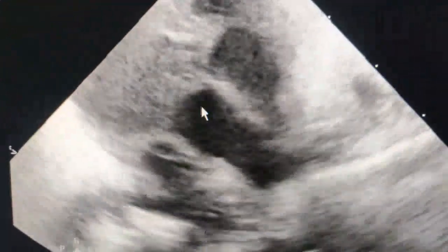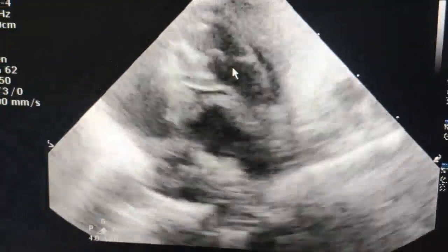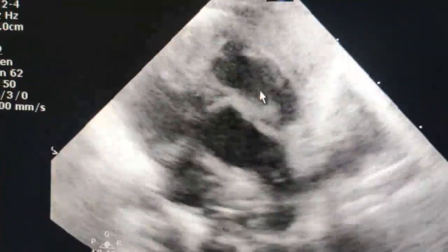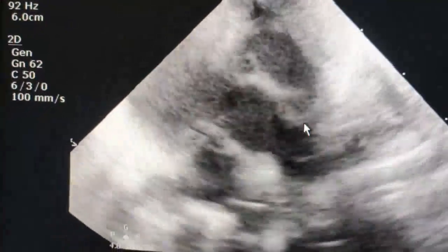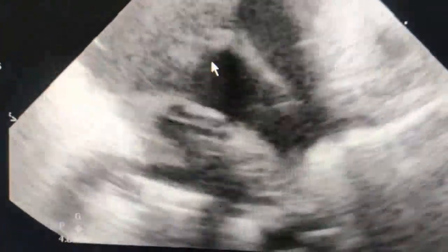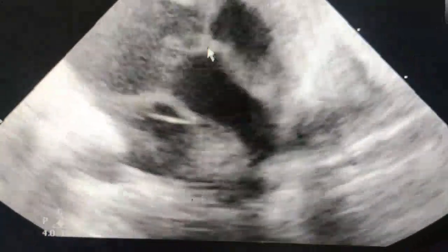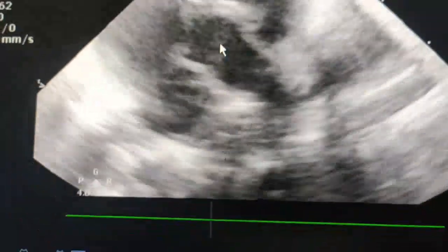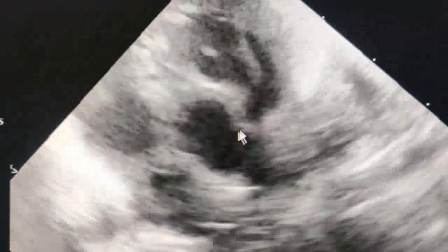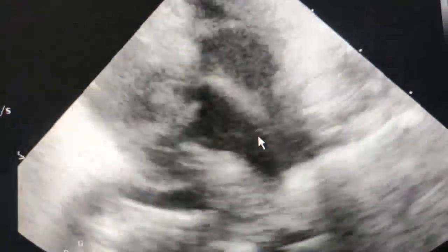Normally, aorta will be here, the pulmonary artery will be here. Correct? What's happening? The pulmonary artery, when it comes from the right ventricle, it should branch. But you see, it is going straight. Can you see that? It's going straight. Aorta, which should not branch, is branching. That means normally this is aorta and this is pulmonary artery. But in transposition of great vessels, this would be the pulmonary artery with the branches. You can see the branches here, the right branch and left branch, and you can see this right ventricle opening into the aorta directly.